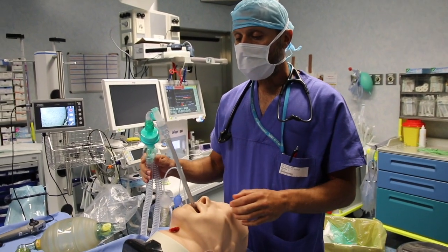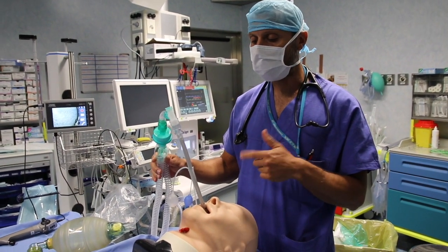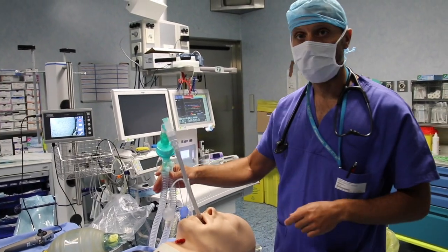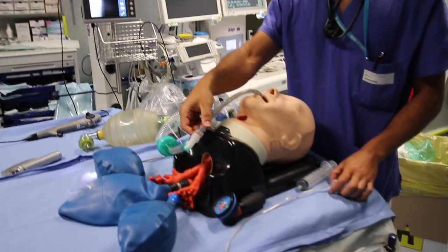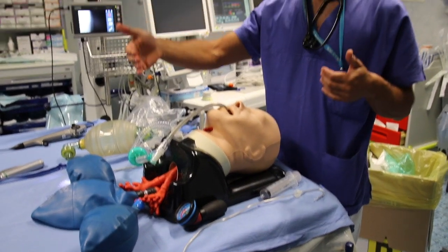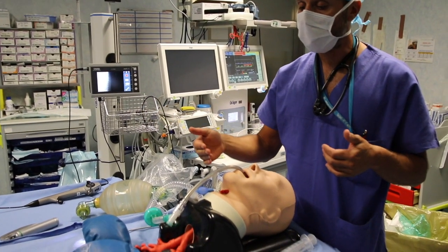Another essential aspect is that the intubation procedure with the video stylet will be performed without interrupting the ventilation of the patient. The instrument will pass through the T-mount with the ventilation circuit constantly connected, which enables us to prolong the manoeuvre for as long as needed, because we are relaxed knowing the patient is being ventilated.